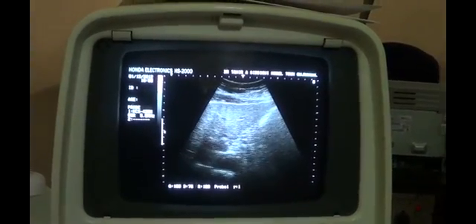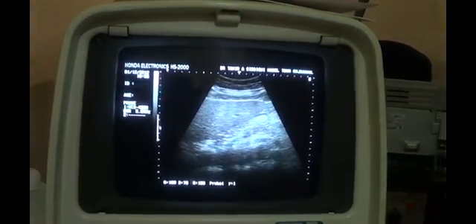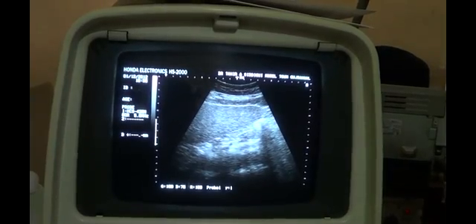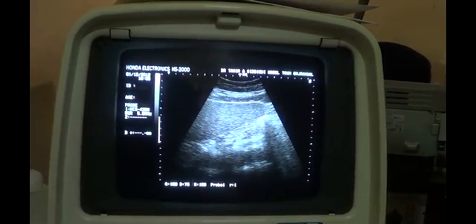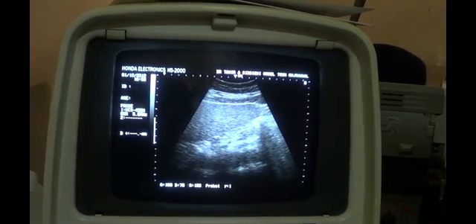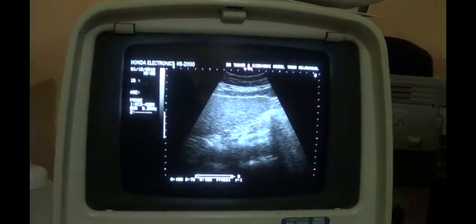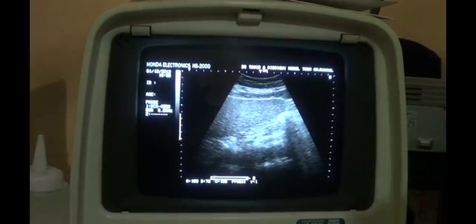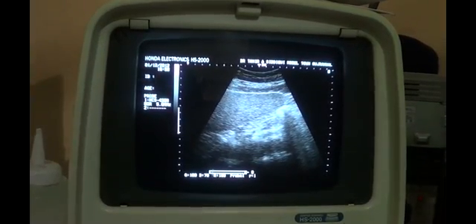This is segment 4 of the study regarding the liver span and size. Now, one important thing regarding the size of the liver is the liver angle. This is the liver angle, and it's not sharp, rather it's rounded. If you see the liver angle rounded, or having an angle of more than 45 degrees, it gives you an impression that the liver is enlarged. Though this rule does not apply to every patient, however, if you do see liver with rounded angle, it is one of the signs of enlarged liver.